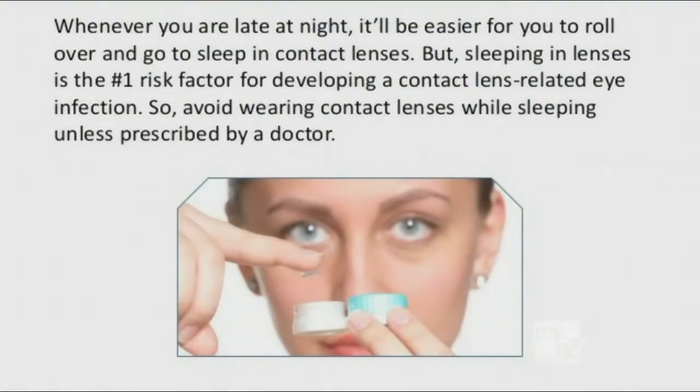You mentioned that, but is there any other way to reduce the damage? Yeah, so you never want to overwear a contact lens, and sleeping in contact lenses increases your risk of infection by about 10 times. So never, ever, ever sleep in contacts, even if you say or hear that they can be worn at night, because it really does increase your risk of infection. Then learning how to put them in and take them out is even something as simple as that. It can be tricky, and you can give yourself an abrasion, which hurts terribly if you don't know how to do that correctly. So all that's discussed when you get a fitting.